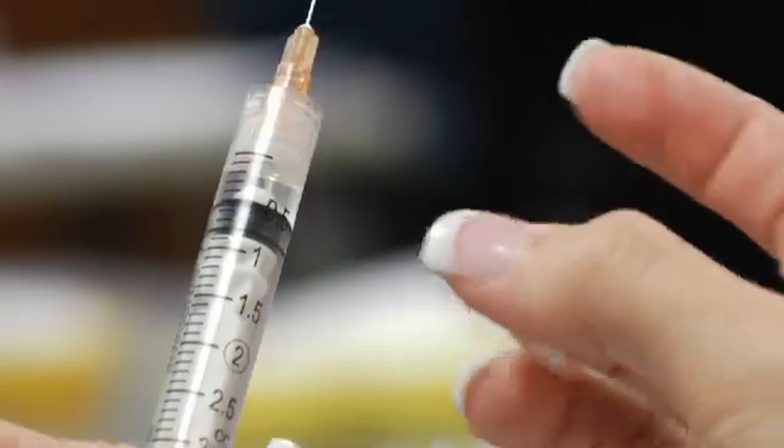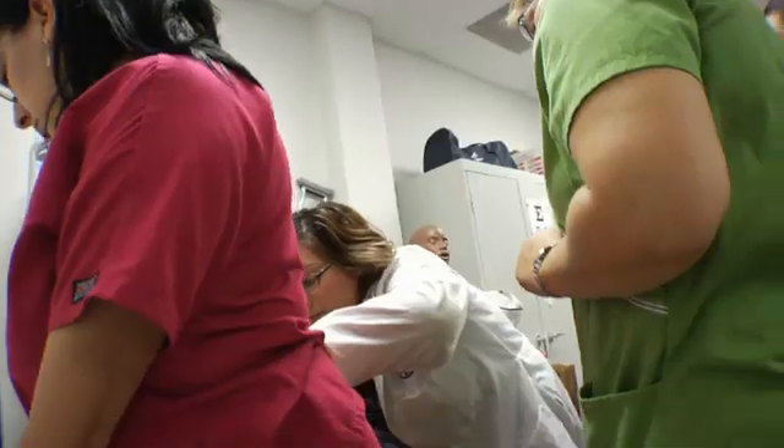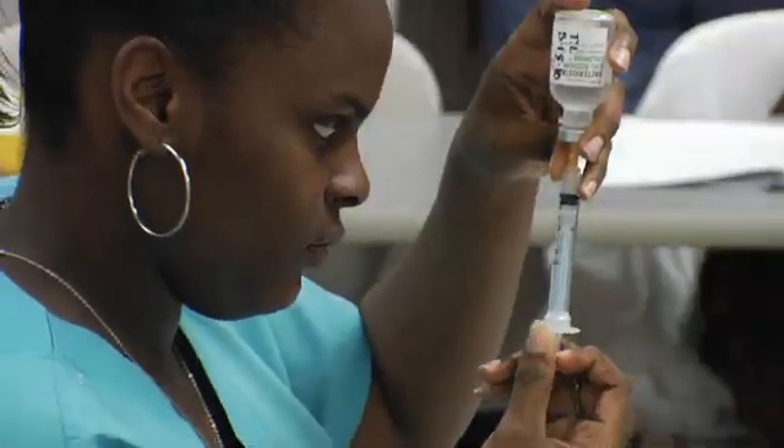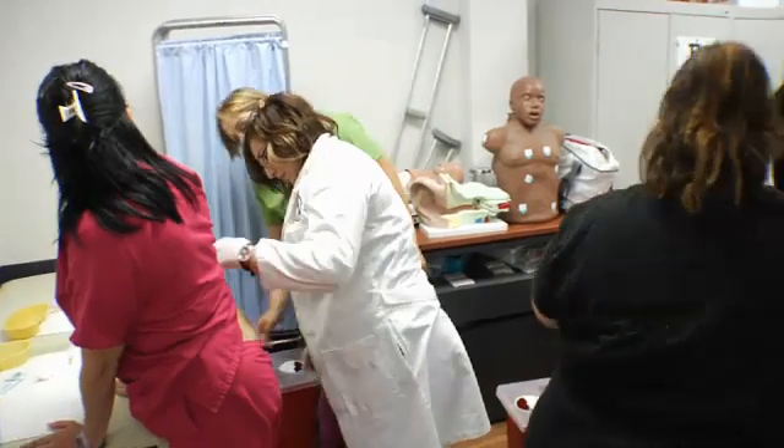Make sure you understand the different types of injections and the different sites for injections, especially in a fast-paced environment where you see quite a few patients in one day. You need to understand your injections and have enough of your medications on hand. Medical assistants can get caught up in technique, but we also have to keep in mind the medication we're giving — check expiration dates, ensure adequate supply, and confirm you have the right needle size according to the injection site.